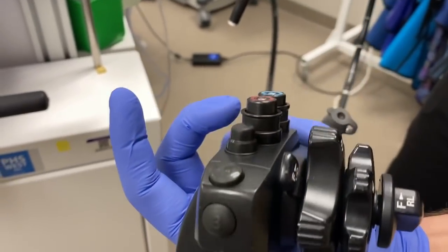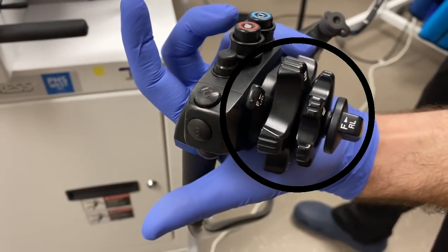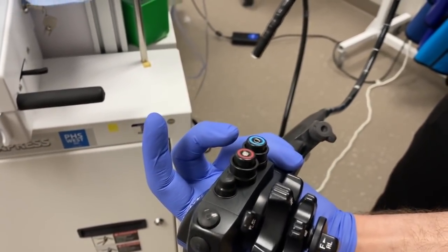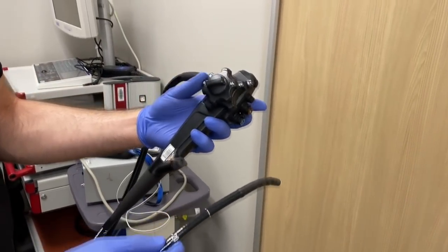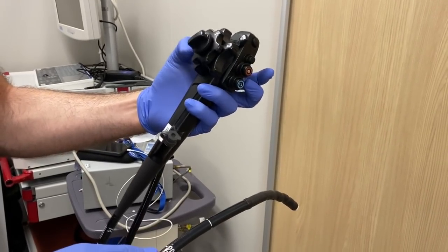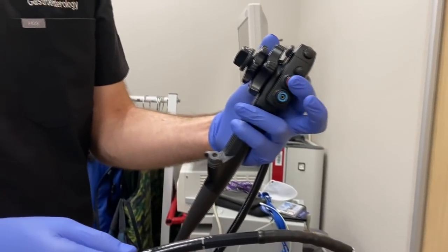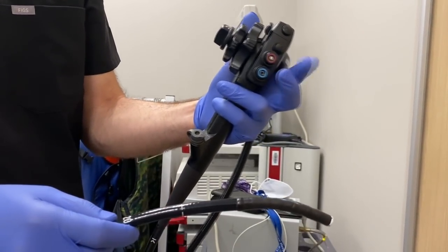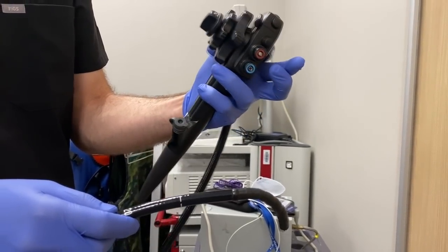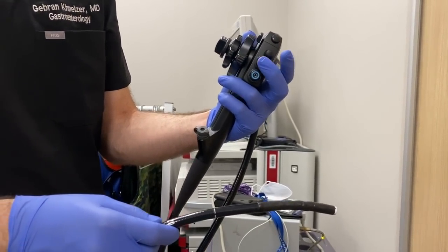Now let's look at the scope — it's got dials, it's got buttons, it's got a lot of things. You can see the two colored buttons we already talked about, and there's a button for taking pictures. These dials let you turn the scope to look up, look down, or look left and right. Jabron has his thumb on the bigger dial that's closer to the buttons — that moves it up and down. Now he's moving his thumb to the left-to-right dial, so you can see the tip of the scope moving from left to right. We also have easy access to click the buttons to suction up fluid, squirt water, or blow air into the stomach.